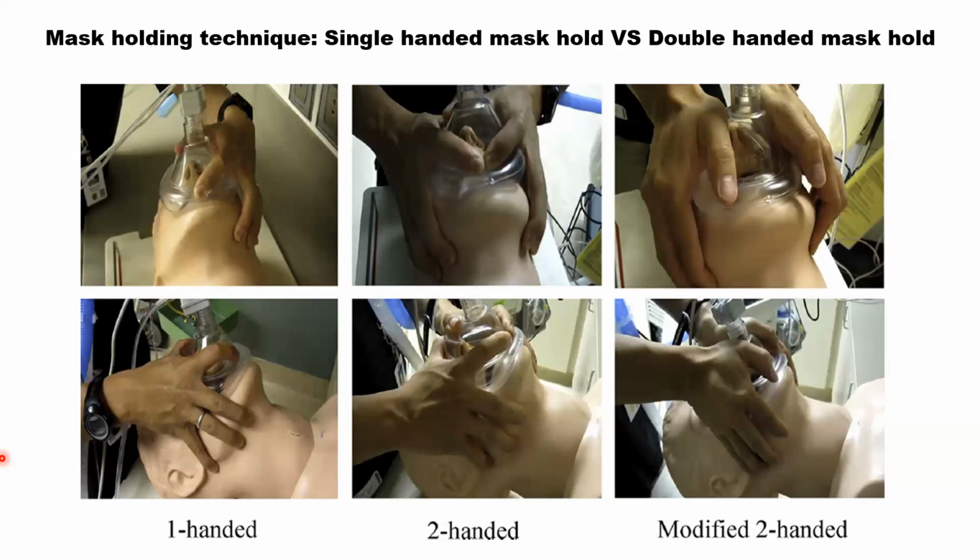So kadang-kadang, selalunya you berjaya semua, intubate semua berjaya lah. Yang tengok HIE. So kita tak nak HIE. So kita punya aim, what's your aim untuk intubate patient ni? The patient discharge well? So that's the end punya goal.